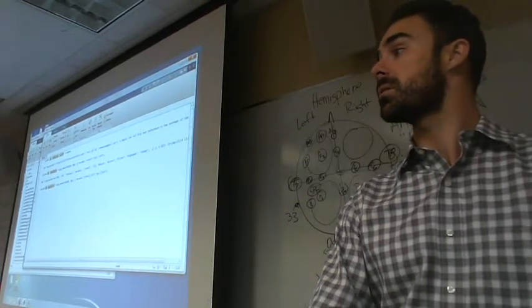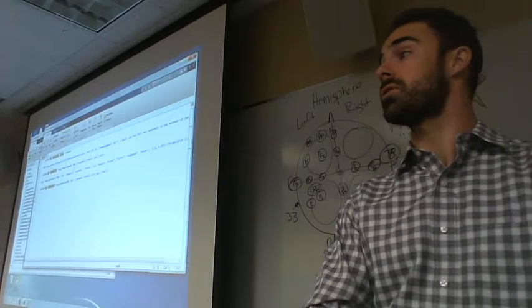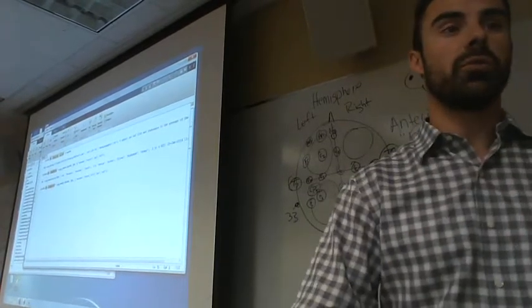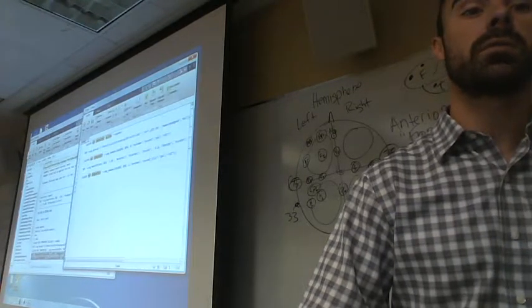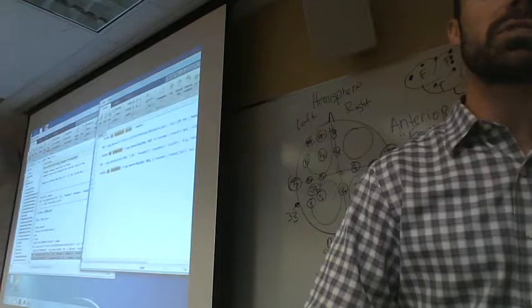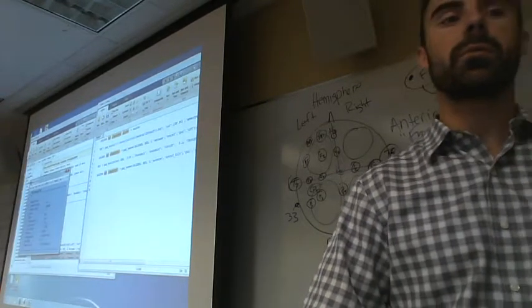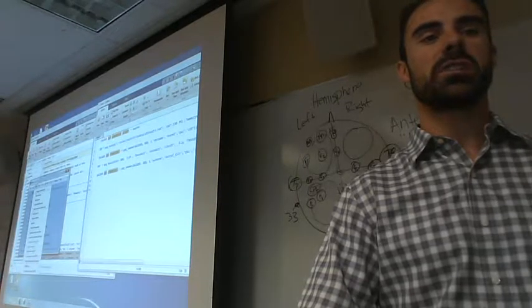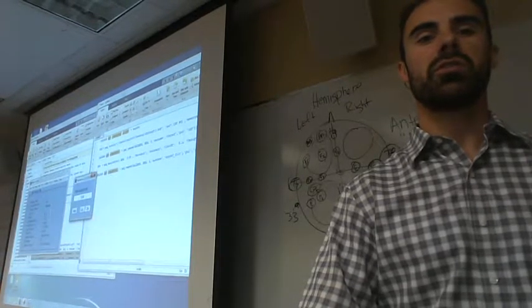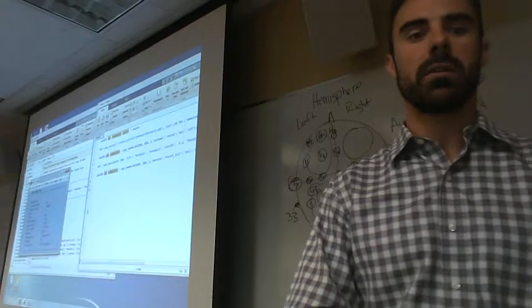Is it making sense? Okay. I know I'm going quick, but that's because we covered this in the first day. So what do we do next? Anybody remember? We resample. We resampled because it's at 1024 hertz. So we come to our tools. We want to change the sampling rate. We're going to turn it to 256 and press OK.